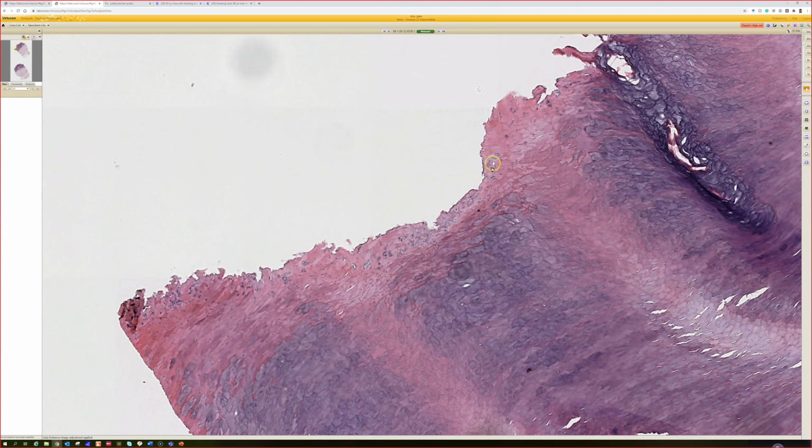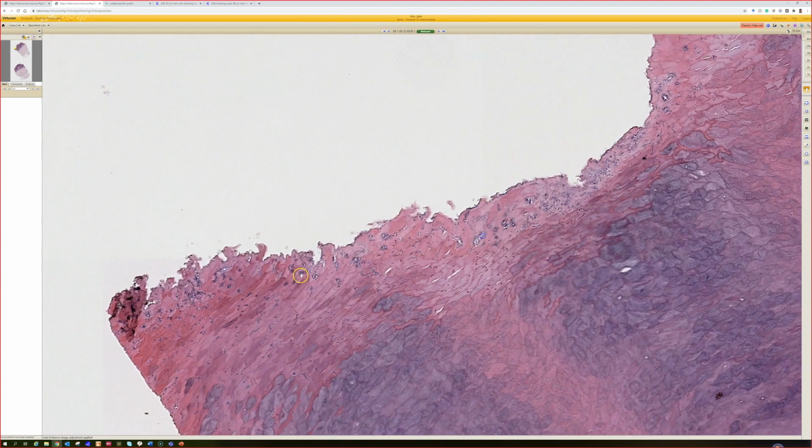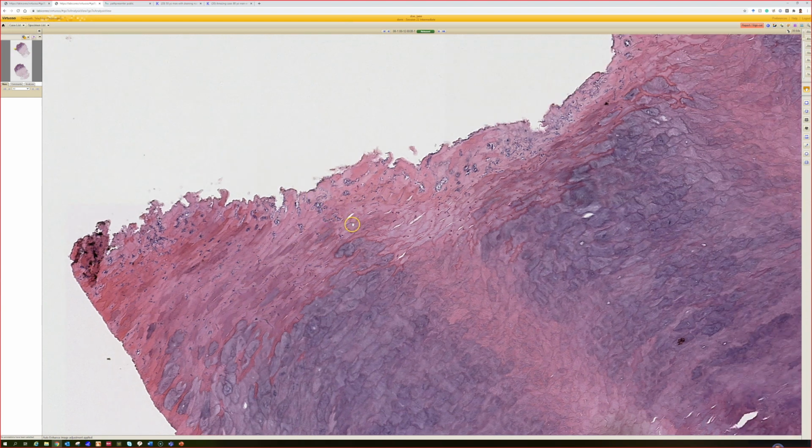Here's more organisms over here. The organisms, again, from the few cases I've seen, are very easy to identify. You can just go see them right on H&E. They look almost like Erythrasma, right? These ones do. They're like little linear. Those look a little more clustered, but it's a florid case that looks like Erythrasma because it's Corynebacterium, but it's on the plantar foot usually.